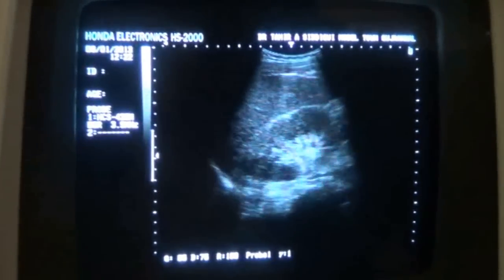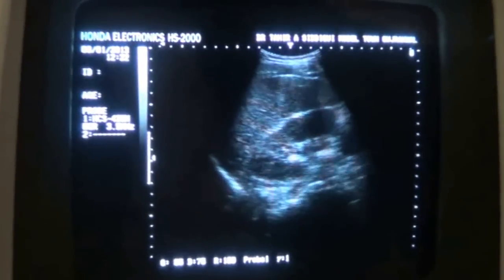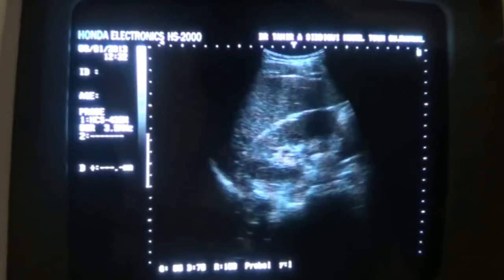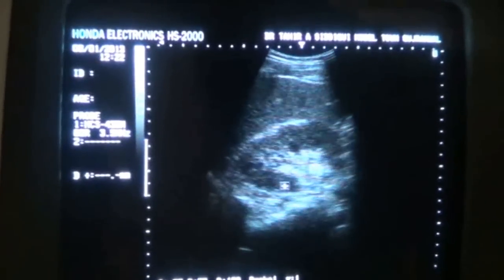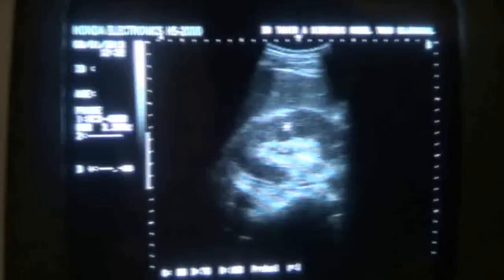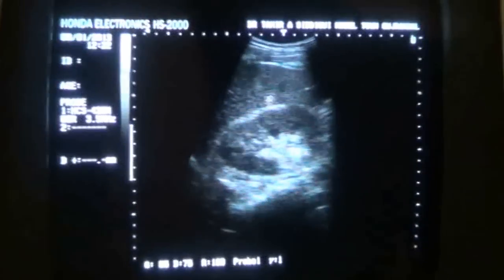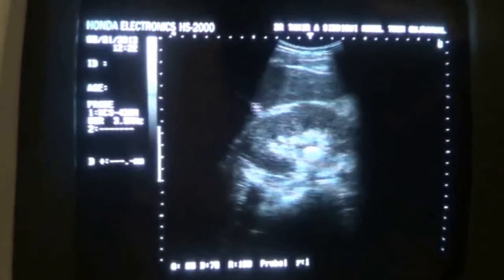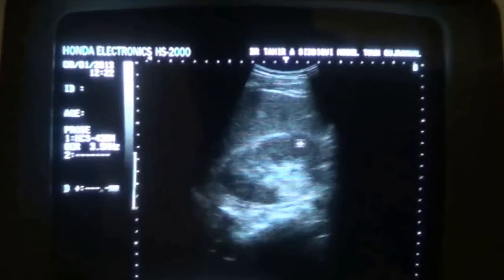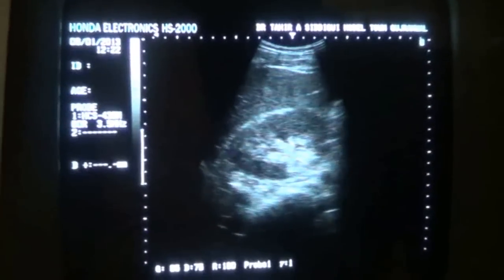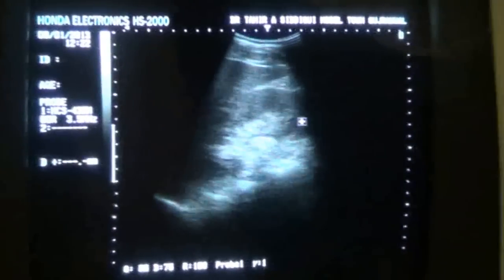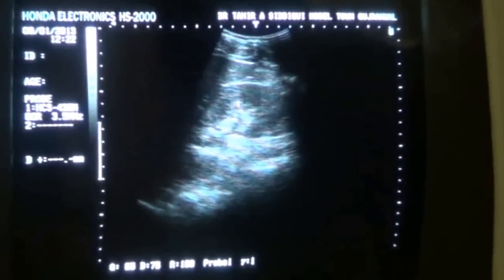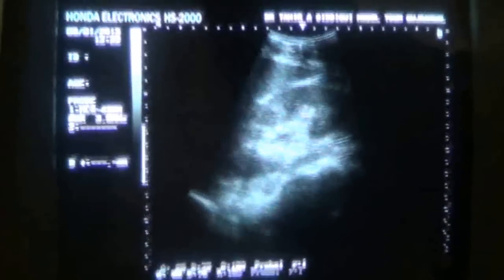This is the right kidney, longitudinal section, with the patient in left lateral decubital posture. This is the liver, this is the upper pole of the kidney, and this is the lower pole of the right kidney.